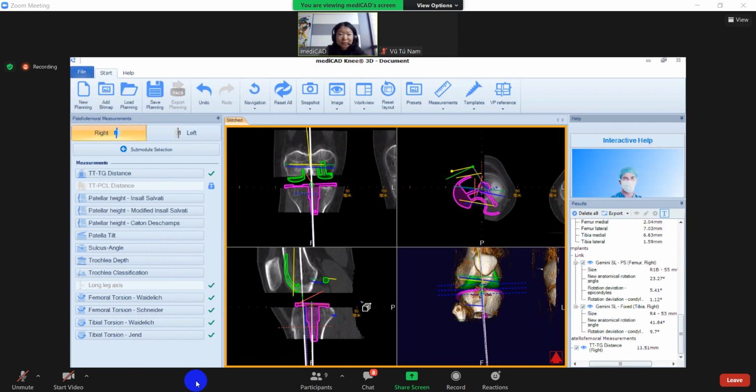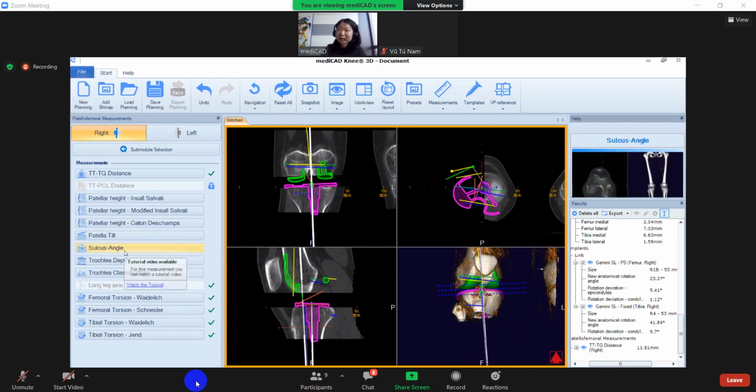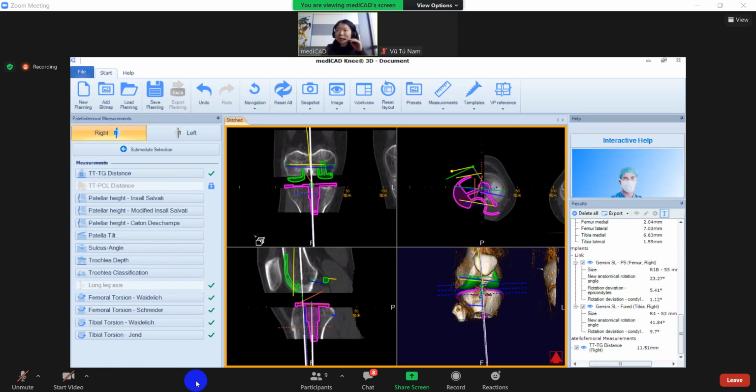What do you think? Which is the best choice, what should we try? We have 3 hours today. I don't know if you have a lot of operations in shoulder or spine, or you are only specialized in knee and hip. If there are also experts here who want to see the 3D spine and 3D shoulder, I would suggest you move on. If not, we can stay a little bit longer in the 3D knee. Depends on you.